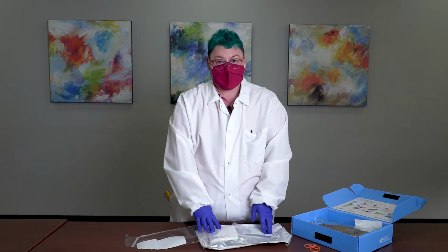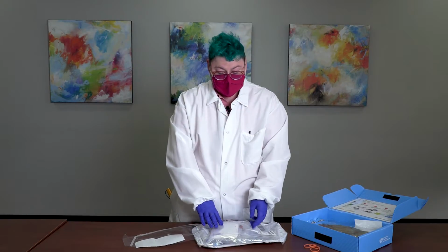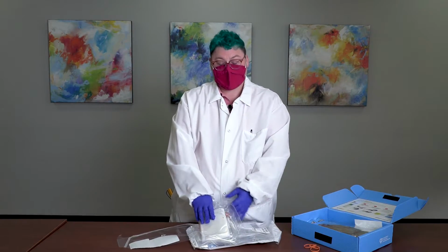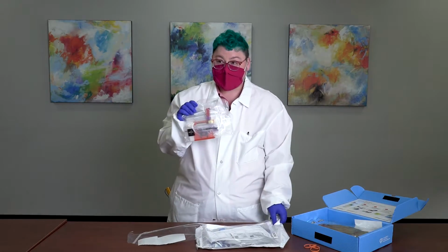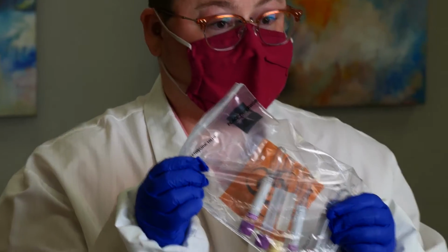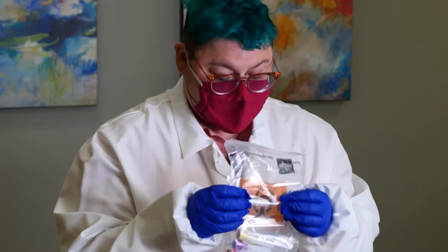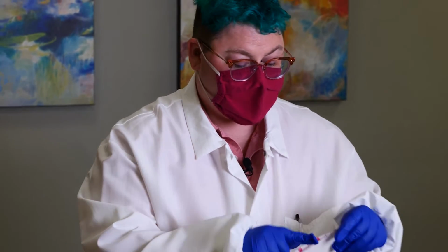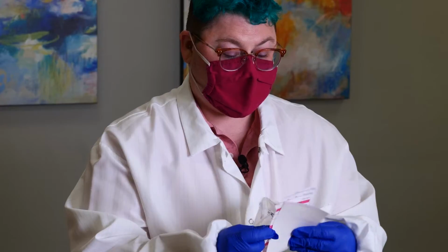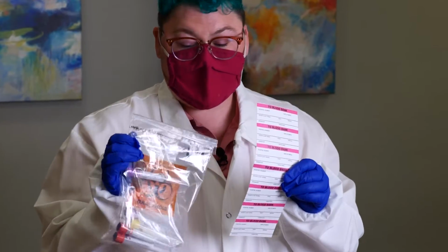Many of our collection sites choose to collect the maternal samples upon admission of the patient, so there's no additional sticks that are required. Maternal samples are inside the collection set. We recommend labeling each tube with a hospital label that's been printed with the patient's name and date of birth. But if hospital labels are unavailable, you can also use these labels that come with the collection set.